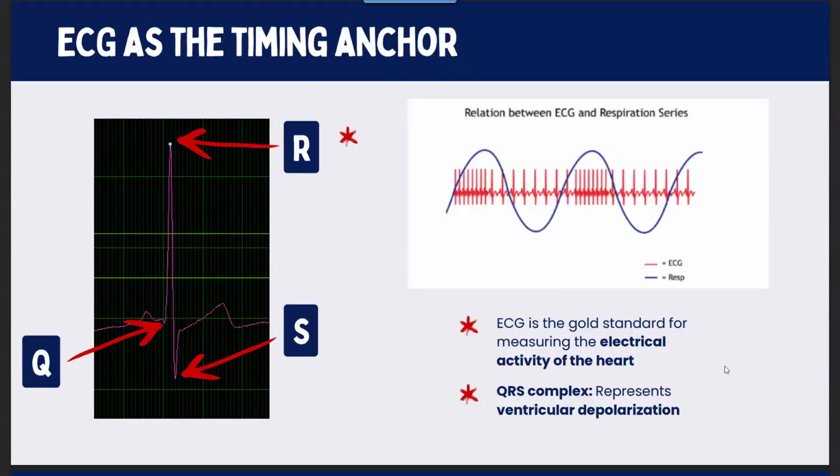So when you think about MindWare, you may think about ECG because this is the most commonly reported metric of all of our measures amongst our customers. And the reason for that is because ECG is considered the gold standard of measuring electrical activity of the heart. And for our purposes today, we are namely going to be paying attention to the QRS complex, namely the R, which provides a really great fiducial point in order to look at the millisecond differences between beat to beat intervals.